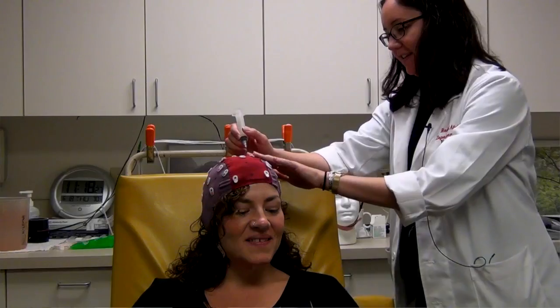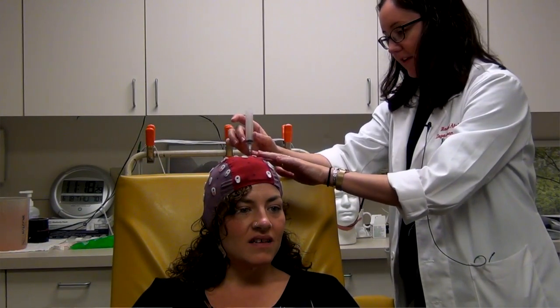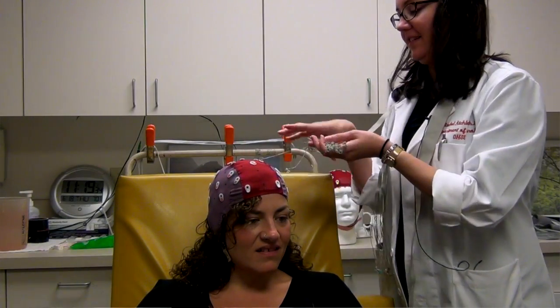Then the EEG cap is placed on a participant and the electrodes are filled with gel. If there are any issues with impedance, you try to address them at this time by manipulating the gel and electrode contact, and abrading the scalp if necessary.